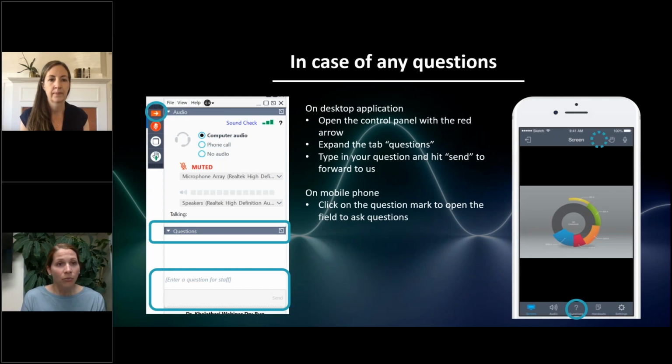Thank you. For Humphrey visual fields, what about using the full field 120 test? I have not used that, but I think it would again be an interesting comparison to really drill down on the disconnect that we saw between the Humphrey visual field and both the photopic negative response and the pupillometry results. Pupillometry and photopic negative are getting at some aspect of ganglion cell unhappiness, the sort of pre-perimetric idea that hasn't yet manifested in vision loss that we're picking up with a Humphrey. We could certainly see if maybe that's not what's missing, but it's just that we're not measuring a big enough field.